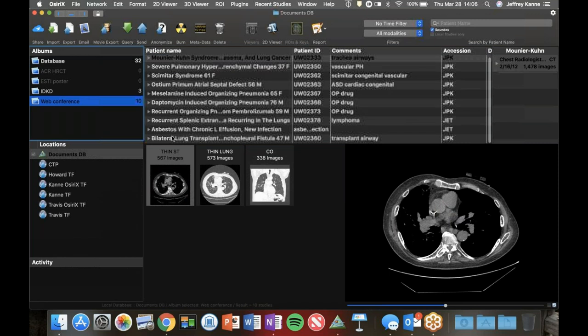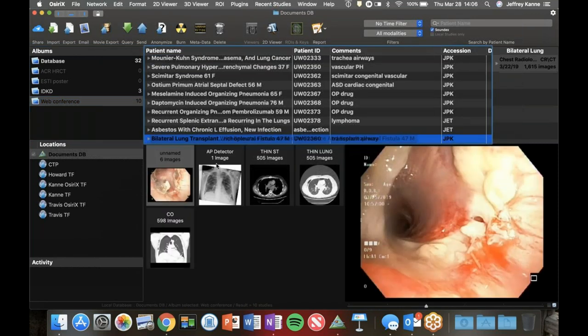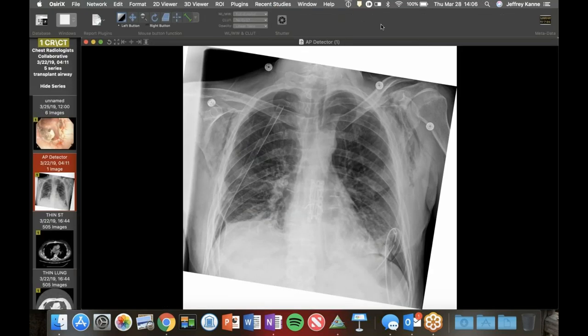So this is a good case. This was a patient who had a double lung transplant, and the post-operative course was complicated by an air leak. Despite tube drainage, there are still ongoing pneumothoraces - not huge, but they're there. They're sort of loculated, which you often see with these transplants. They get adhesions and all sorts of things.